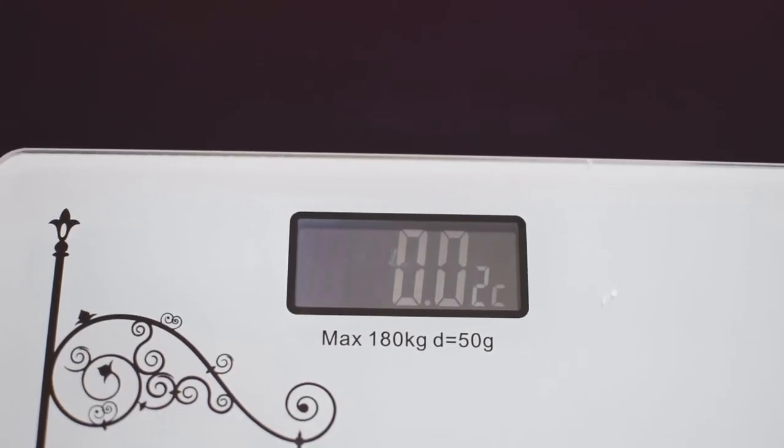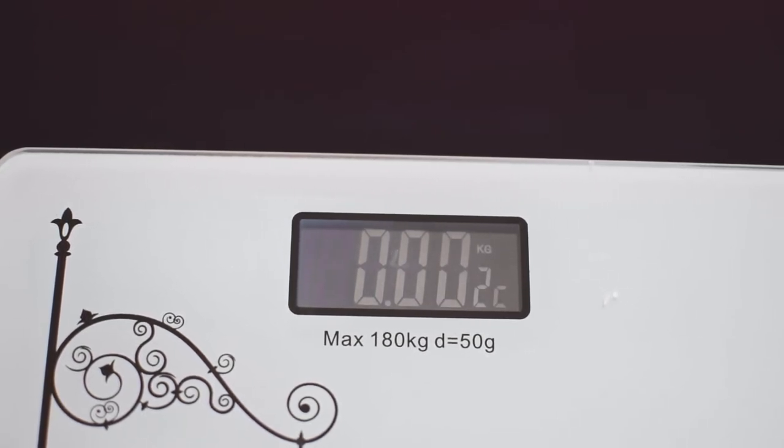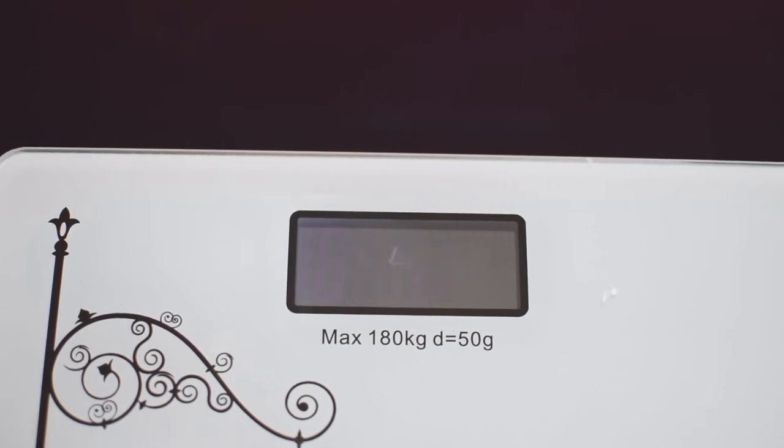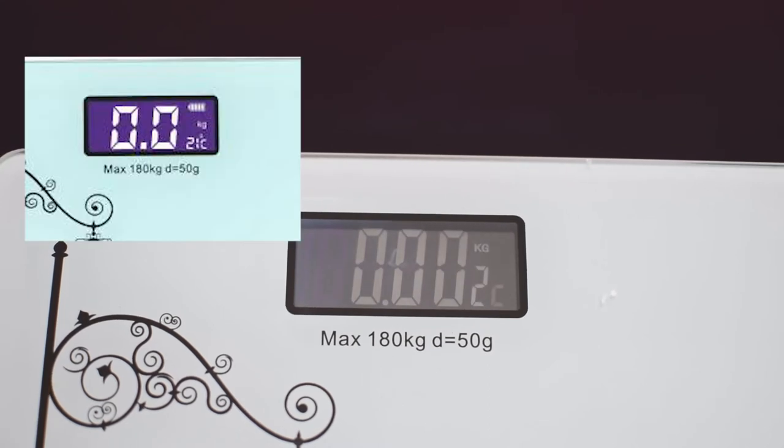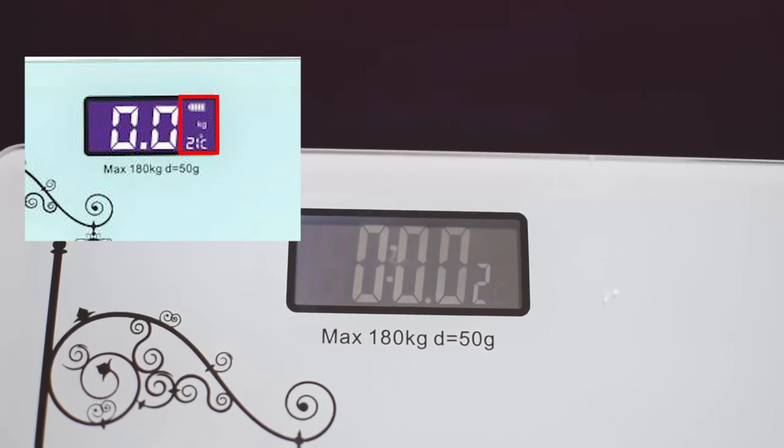On the LCD display, the weight is displayed in kg or in lb, that is in pounds. At the top right side there is a battery indicator, and below it we can see the current temperature. On my display it is showing 22 degrees, but the temperature and battery indicator are not showing correctly — I think the batteries are weak.